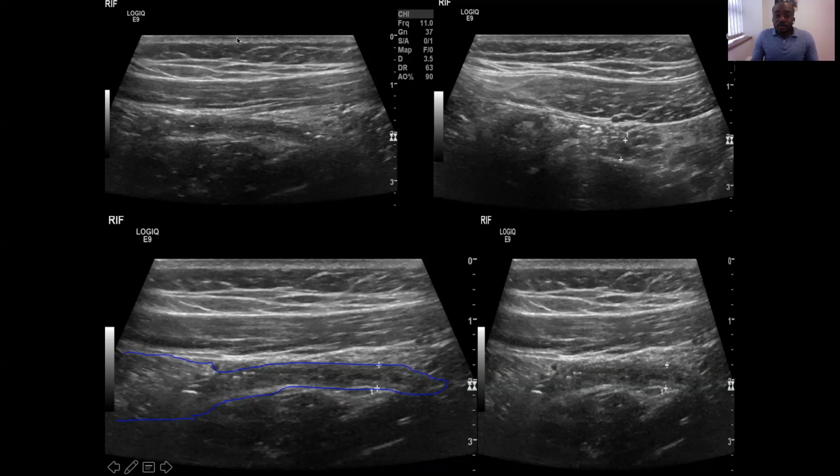If you look at the top left corner of your screen, there's skin, subcutaneous layer, so superficial subcutaneous layer, deep subcutaneous layer. Then we have the anterior abdominal wall muscle, and then from here you can start having the peritoneum and the bowel. So this here is the appendix.